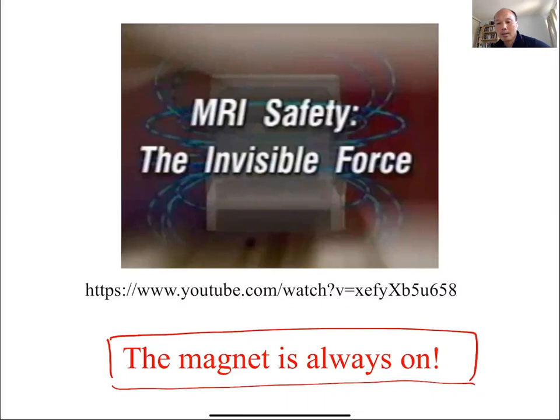Yeah, so in terms of what's safe, everything just has to be really tested before you bring it into the magnet room. So we make sure that there are fairly strict standards in terms of making sure that things are not ferromagnetic. And so unless it's quote magnet safe, you're not allowed to bring it into the room. And the energy, yeah, so the energy is stored in the magnetic field. So from basic E&M, once you have a magnetic field and given the current and the volume, there is some stored magnetic energy in there. And if you bring an object into the field, it will certainly be pulled in, and we'll talk about that in a minute. There's so much energy there that what you're doing is almost negligible.